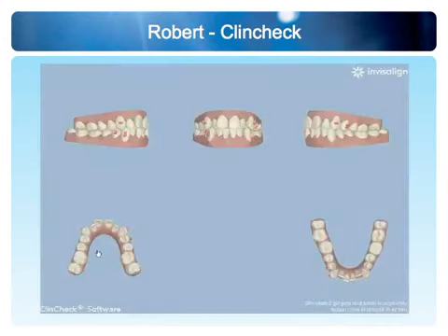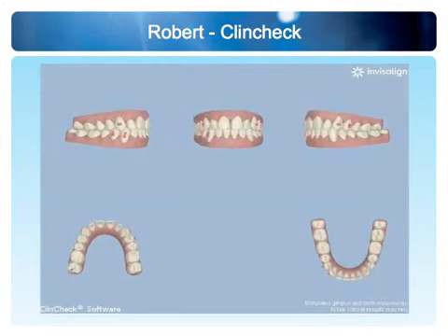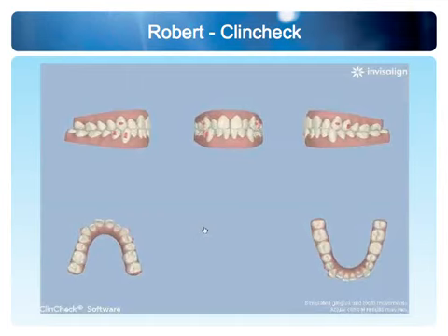My favourite view is obviously the upper arch, and that upper arch has that beautiful omega shape which we want to get rid of. And the way to get rid of that is with Invisalign. That would be the choice of treatment for this arch every day of the week, to get Invisalign aligners in there to do this. Expand and provide proper arch form and proper arch width. Now we have a beautiful Roman arch. So we've taken the omega shape arch and created a beautiful Roman arch. And now you're ready for the lower to follow it and have all those teeth fit in with the minimal amount of IPR.